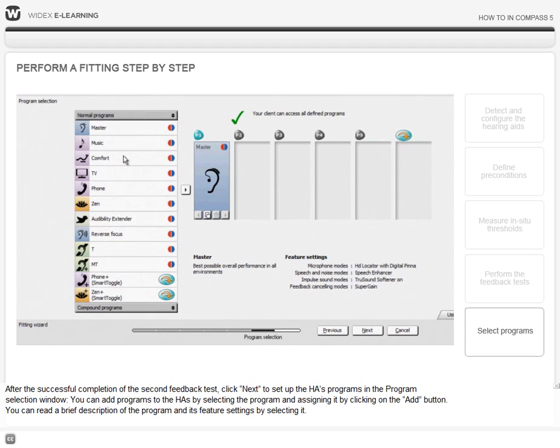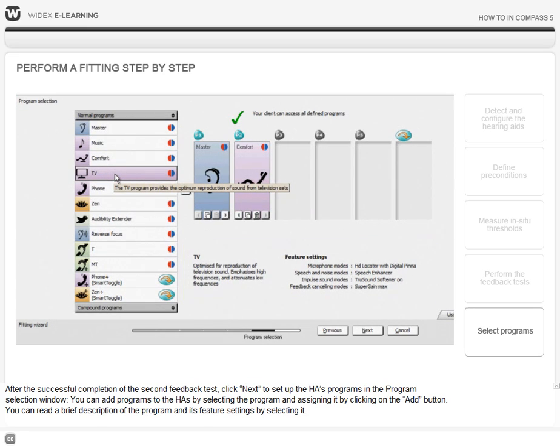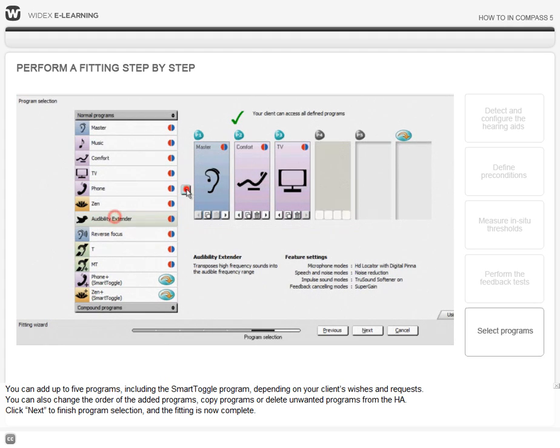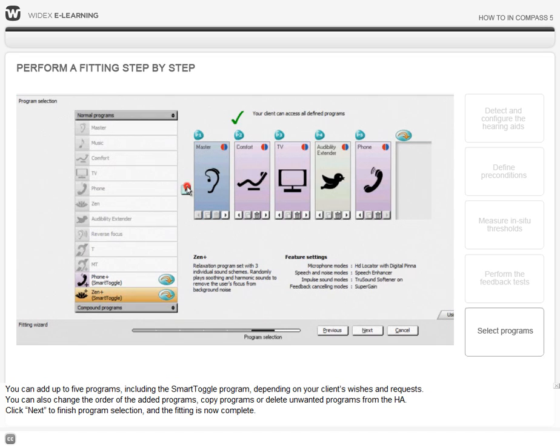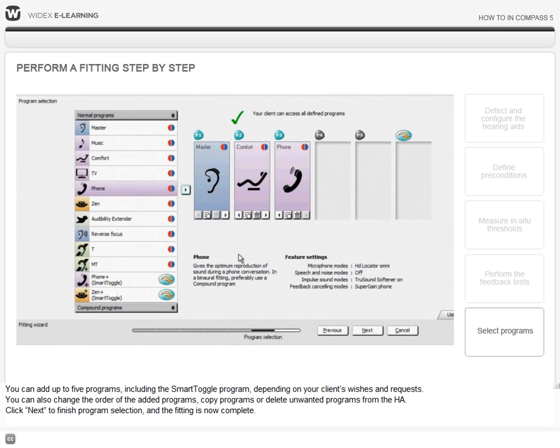You can add programs to the hearing aids by selecting the program and assigning it by clicking on the Add button. You can read a brief description of the program and its feature settings by selecting it. You can add up to five programs, including the Smart Toggle program, depending on your client's wishes and requests. You can also change the order of the added programs, copy programs, or delete unwanted programs from the hearing aids.